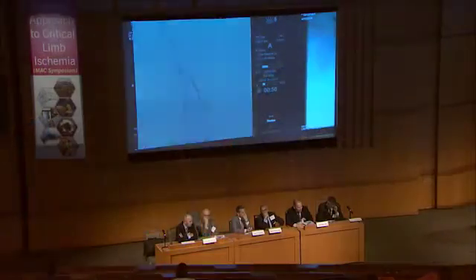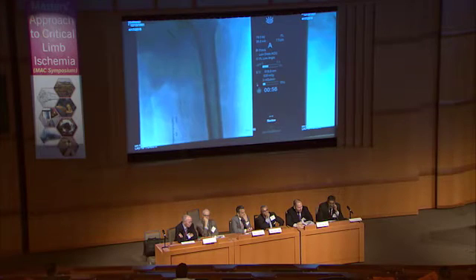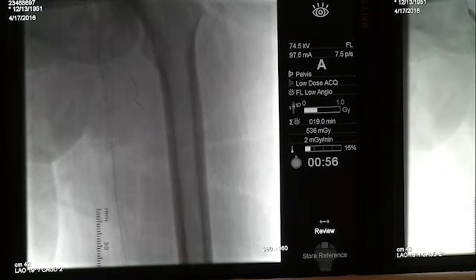Can we see a little bit more distal? That'd be nice to see the rest of it. Go ahead, let me put it higher. I don't. It seems like when the balloon is up, there's not a lot of fistulous flow, which suggests that the fistula, or the majority of it, is coming from the profunda. Perfect. Dr. Manzi, you agree? Yes, of course.